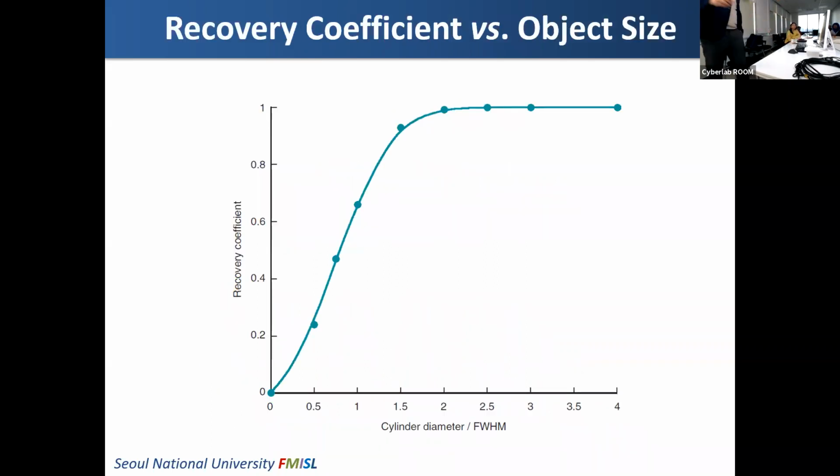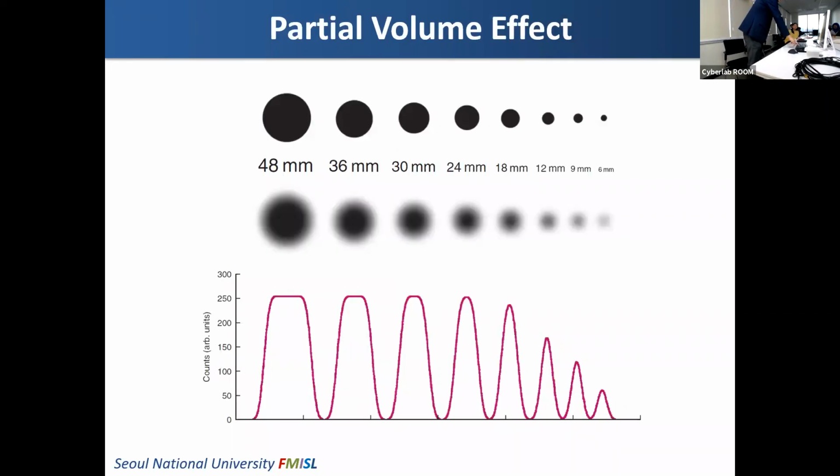The resolution recovery coefficient means the ratio between the measured activity and the true activity. Okay, resolution recovery coefficient. If you have a large sphere, the recovery coefficient will be 1. But if you have a smaller size, the recovery coefficient will be smaller than 1. Okay.